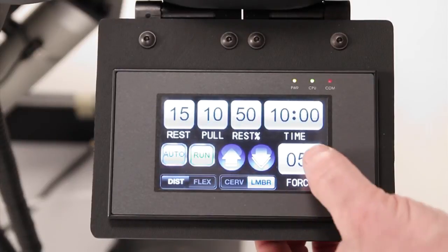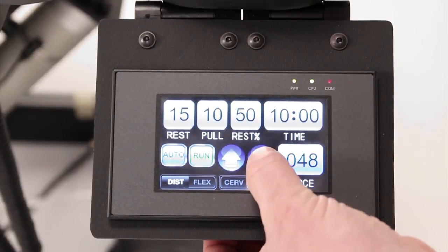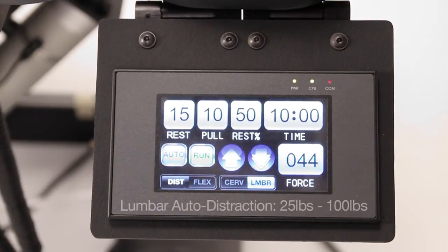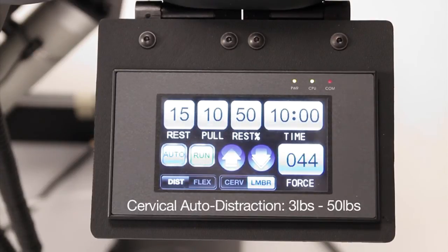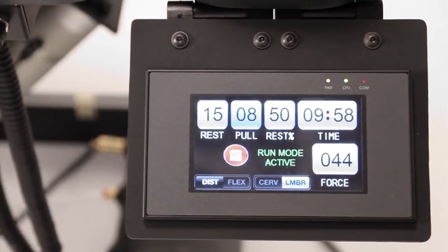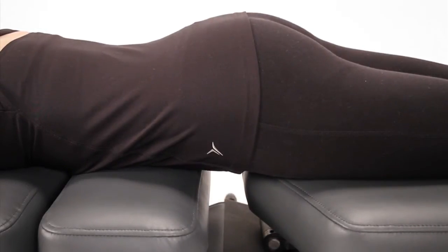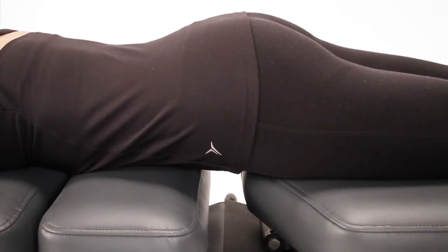Tap the manual button to switch to automatic mode and set the force setting. The treatment force is measured in US pounds. It is programmable from 25 pounds to 100 pounds for a lumbar treatment and 3 pounds to 50 pounds for a cervical treatment. When all desired settings are entered, touch the green Run button to start the treatment. Your patient will now experience traction that is smooth and consistent.